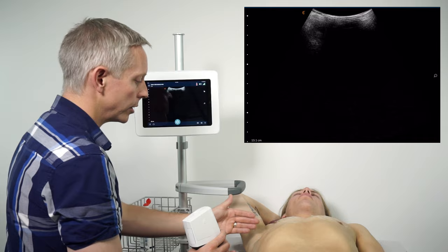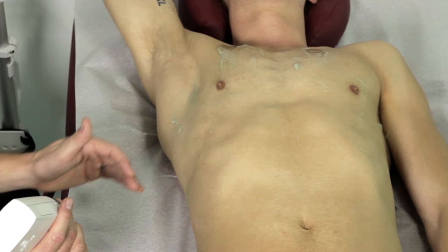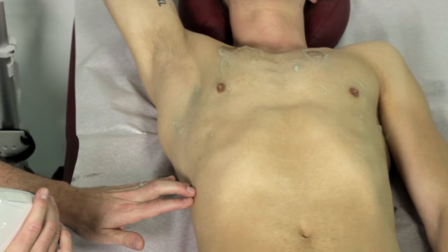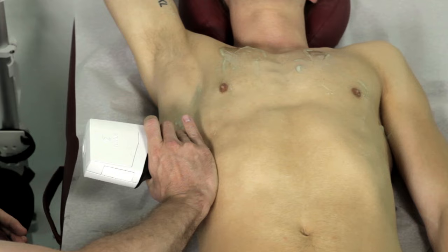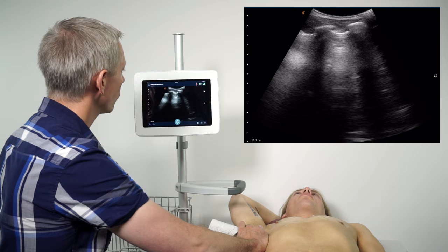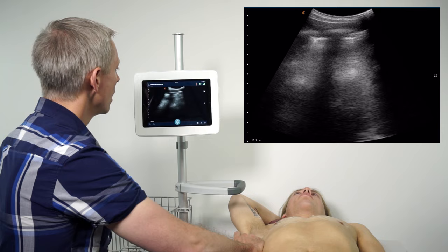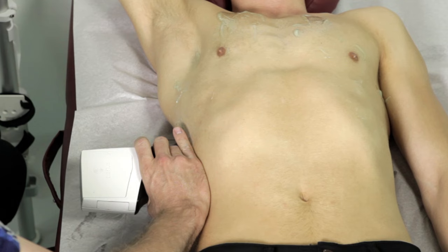Moving down to the inferior lung zones, I first want to differentiate between the abdomen and the thorax to ensure I'm at the most inferior portion of the lung. On the right side, using the external landmark from about the height of the epigastrium down to the mid-axillary line, I place my transducer in that position and land right on top of the liver. I've clearly delineated where the abdomen is, and as I slide the transducer up into the patient's chest, the normal lung pattern comes into view. I'm at the border of the chest and thorax, and to fully interrogate for a small pleural effusion I'll come down to the most inferior portion of the chest to identify that most dependent region.